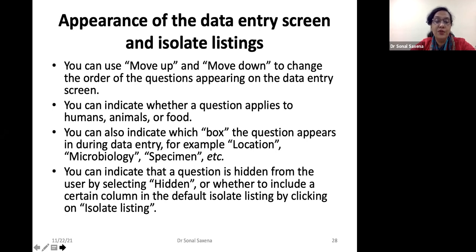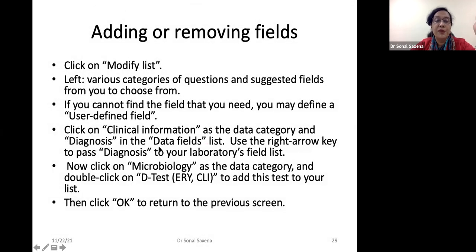You can also encrypt the data when you're sharing it with the laboratories, but please create a copy first, because when you encrypt the data, everything gets encrypted, the name, the age, the sex. And what happens is that the data goes to the other person, and now you can't de-encrypt it. So please make a copy. If you're sharing data, make a copy for yourself, keep the original, and encrypt the copy that you make, so that your data is not user identifiable. Because sometimes there can be privacy issues, there can be a breach of privacy, and you can land up in lawsuits.